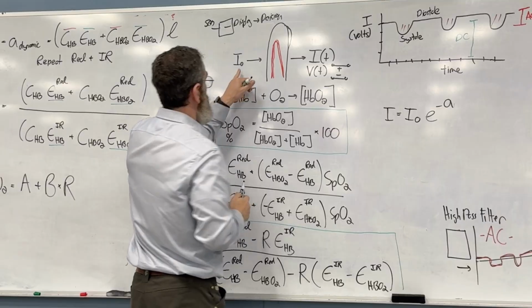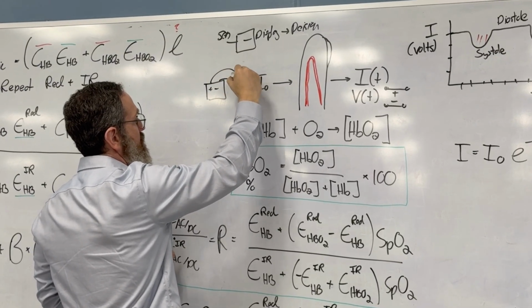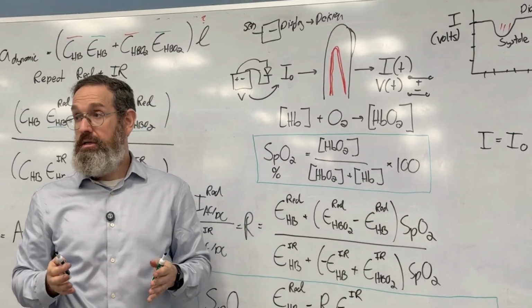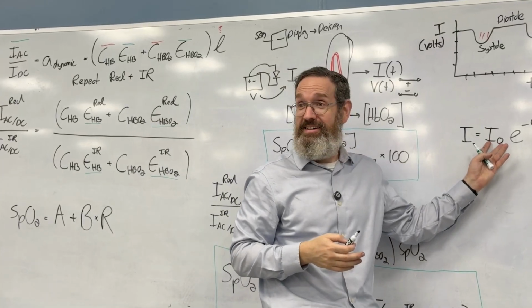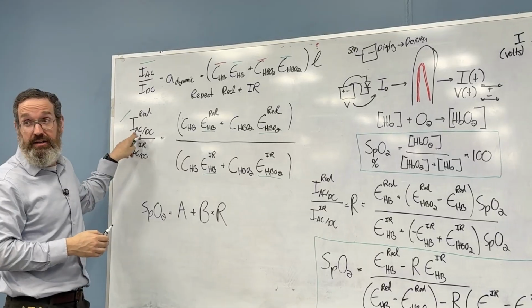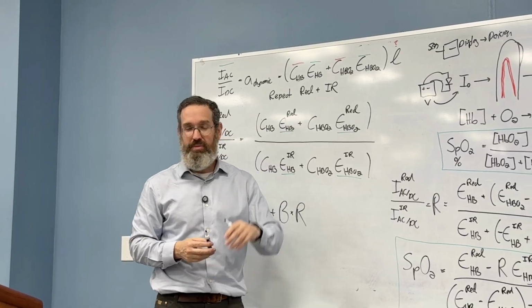when you build your light source. So you have, I don't know, a 9-volt battery, and it's connected to some sort of LED, right? And for the voltage you put in, you get some light out. Seems pretty important to know that. I mean, if you don't know this, aren't you cooked? Everything we did here had to do with calculating I. But if you say, oh great, I built a pulse oximeter, I'm ready to do my math, how much current did you put in? I don't actually know, because there are a lot of issues.